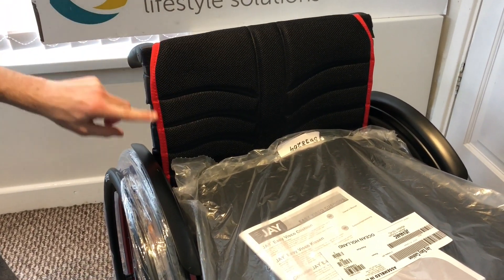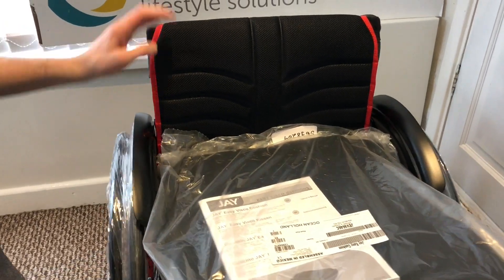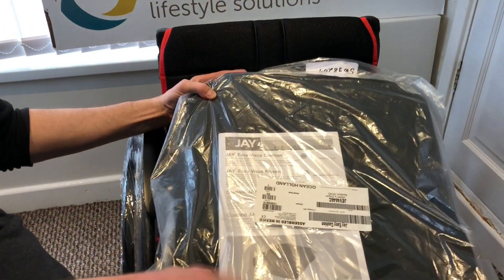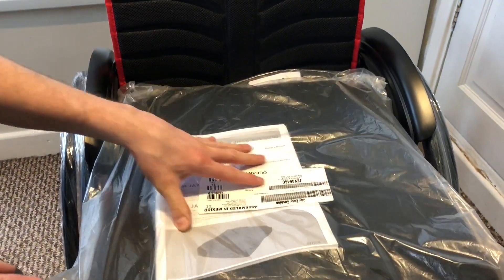It's the breathable backrest with the colour-matching stitching. The cushion that the customer's gone for is a JAY Easy Visco cushion, which is great for pressure relieving.